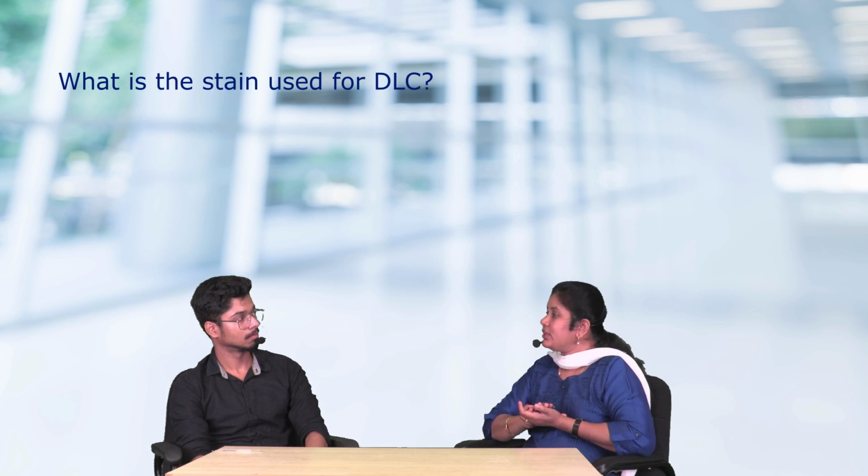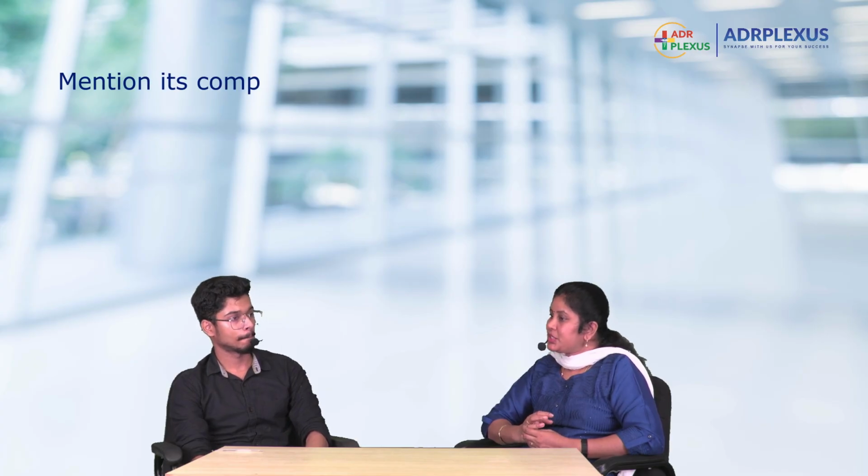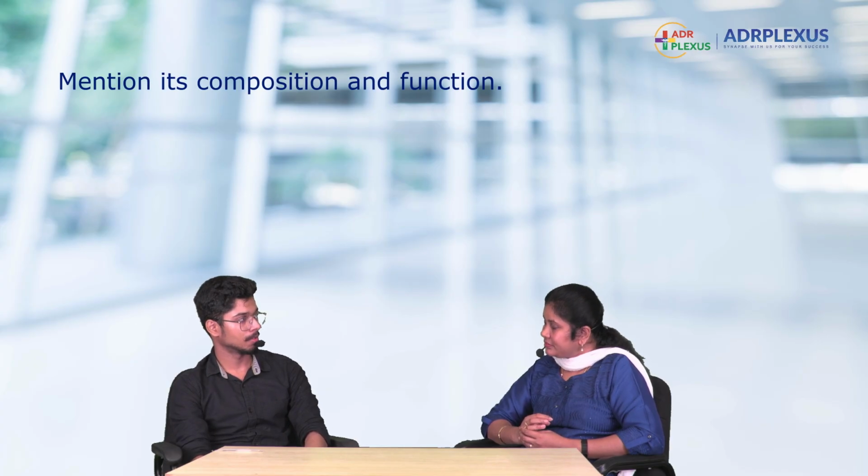What stain will you use for doing differential leukocyte count? Leishman stain. Tell me the composition and function. Methylene blue, eosin, using acetone free methyl alcohol. Methylene blue stains the acidic part, that is the nucleus. Eosin stains the basic part, that is the eosinophilic granules and hemoglobin.